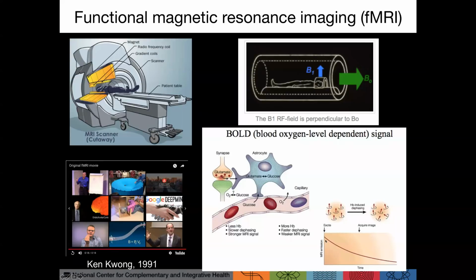So basically what happens is when we use this B1 signal to excite the response, it kind of sends all the magnetic pulses in different directions, and then the receiving coil waits to see how long it takes for the signals to get back in line. And so given that there are differences between oxygenated and deoxygenated hemoglobin in terms of their magnetic properties, that's why the MRI scanner is able to pick up on differences in activity.